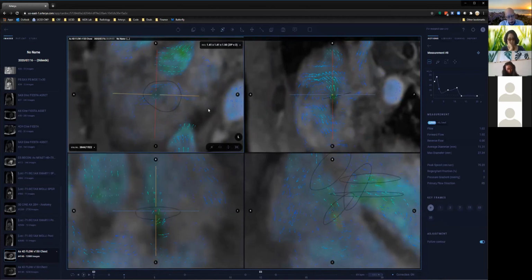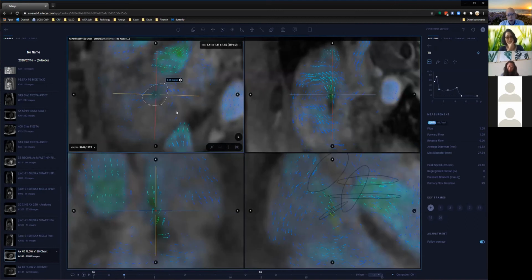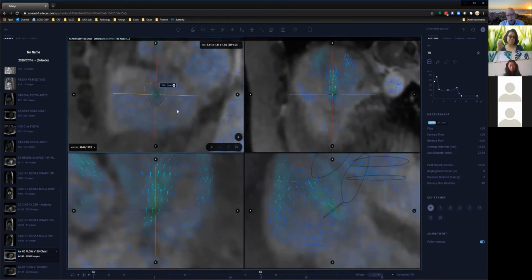When you guys are doing 2D phase contrast, Kathy, do you guys do multiple cuts through the valve, or what is your typical strategy? Oops, I think you're muted. Yeah, for the aorta and pulmonary, we usually get at least 2. And mitral and tricuspid, especially mitral, we do that subtraction. But the direct measurement has been challenging, and it's very inconsistent value.